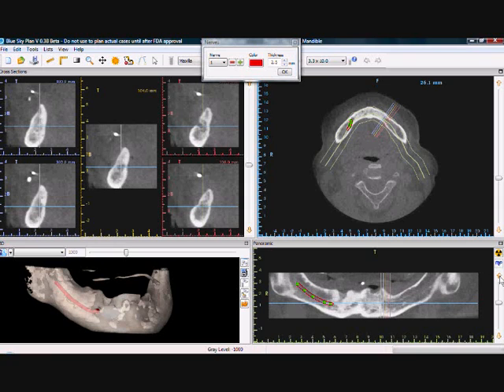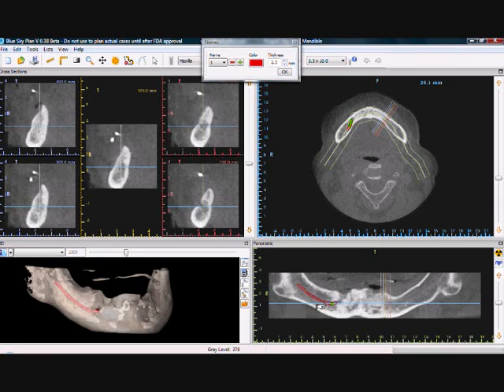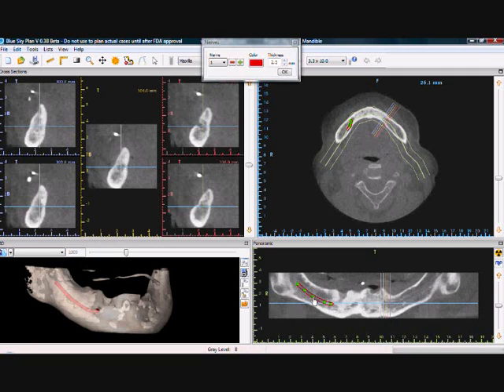Nerve placement can be modified by moving the cursor over a green node that was placed, then clicking and dragging on that node, and the nerve will be redrawn accordingly.